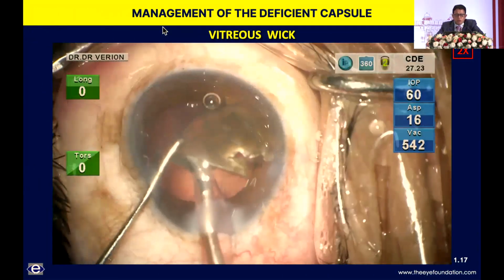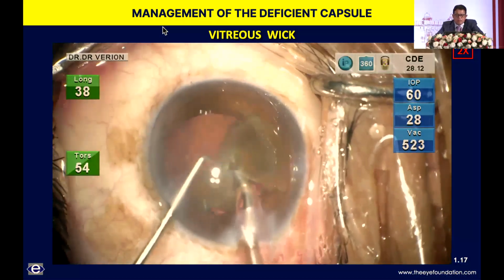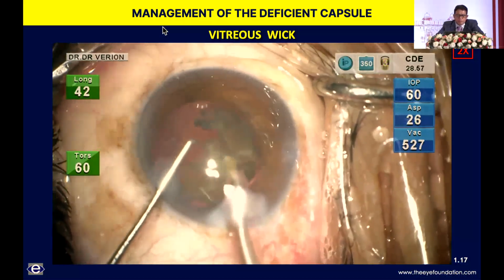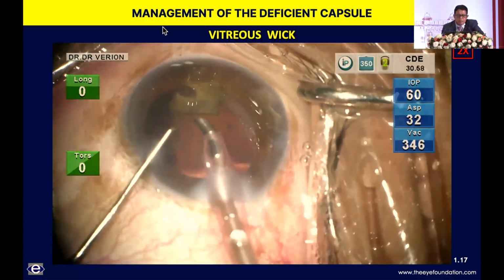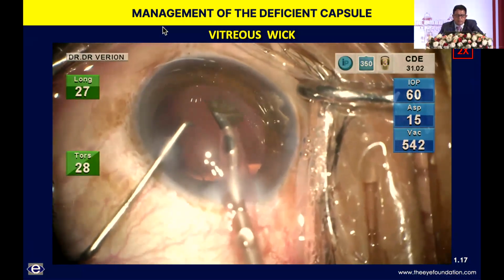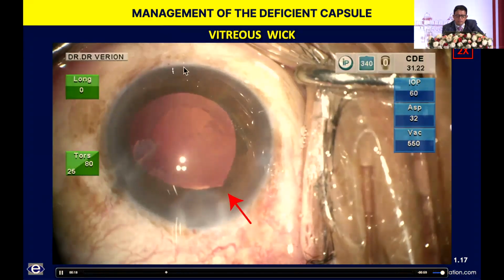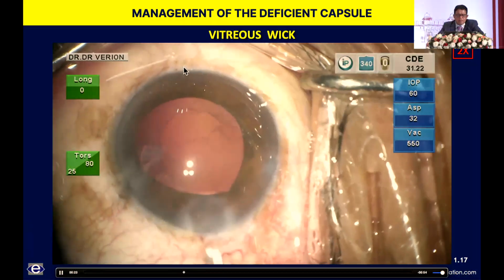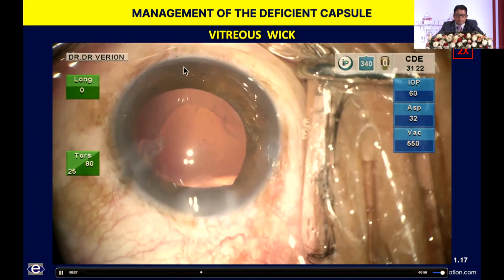This is just to show you the simple cues that might tell you there could be a vitreous disturbance. Again, everything seemed to be under control and this surgery was proceeding quite smoothly. But as I evacuated the lens quite completely, you can see this simple distortion over here, which is pointed out by the arrow over there. Without any chafing of the iris, this kind of distortion itself tells me there's something wrong.